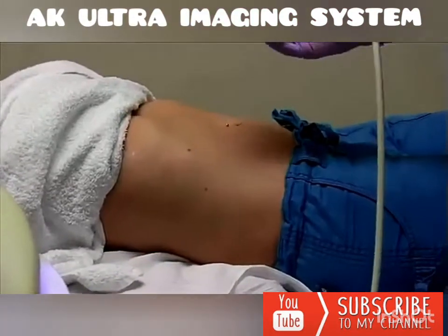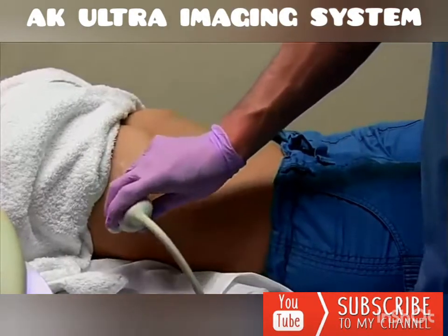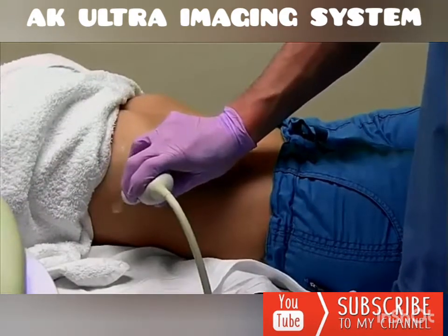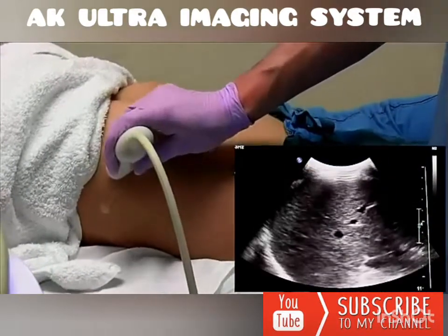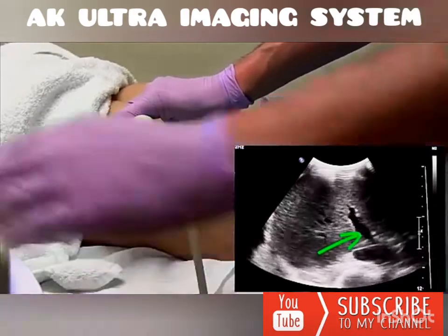Okay, another window we can use to get the porta hepatis and the CBD is this intercostal right window again. This is a good window for if you're going to do any pulse wave Dopplers, because usually the main portal vein sets up at about a 60-degree angle.